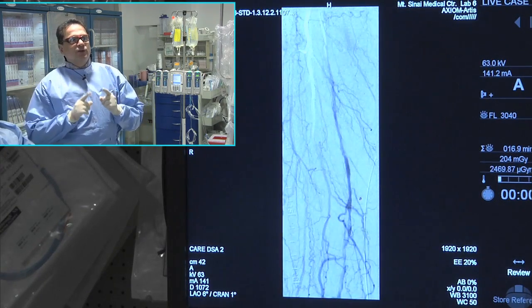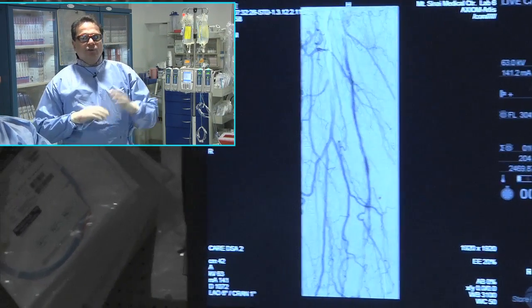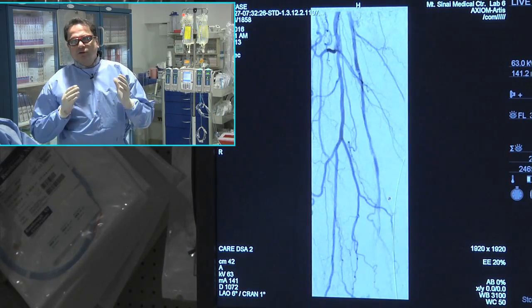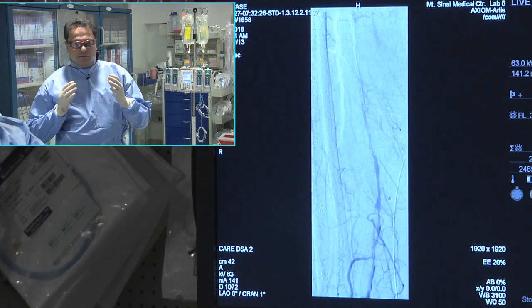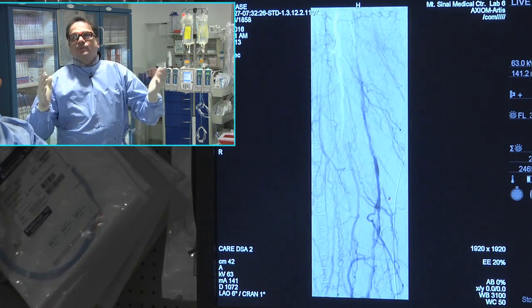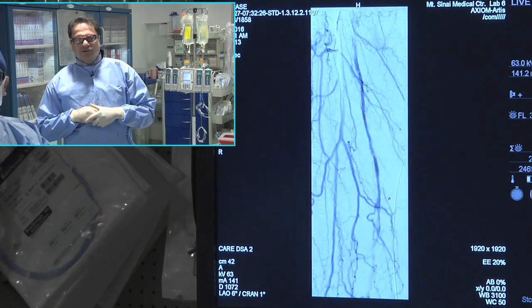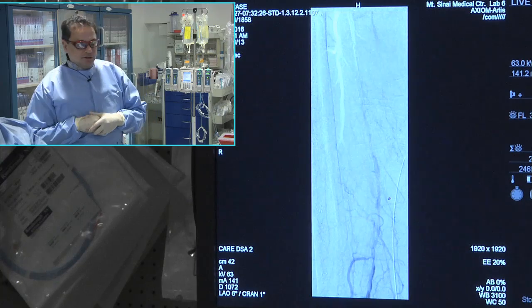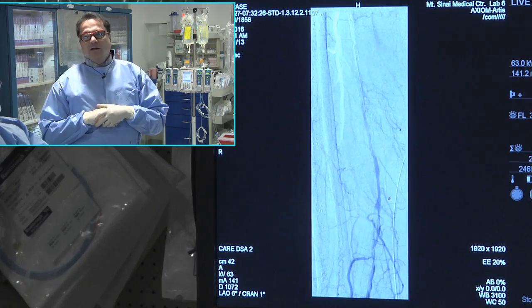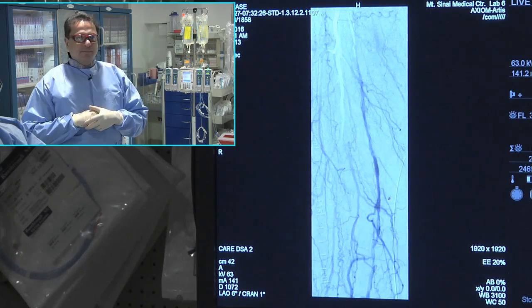But remember, in today's world of DCB, DES, or covered stent technology, or leave nothing behind, you need to start looking at it. And the sparsity of data here really lies in atherectomy. There is really no long segment atherectomy data that's available to us in looking at lesions of 25 centimeters in a large patient cohort. I know Zeller's reported a lot of stuff out of smaller patient cohorts and out of single center experiences. We don't have multi-center even registries to talk about with this. We don't have that with the Jetstream atherectomy either. We know that the different Jetstream atherectomy IDE studies all included only short lesions.